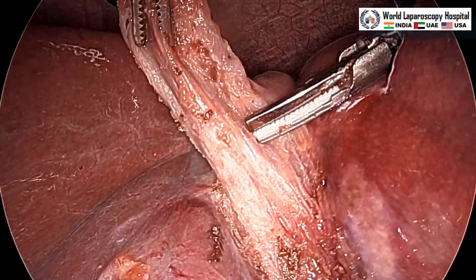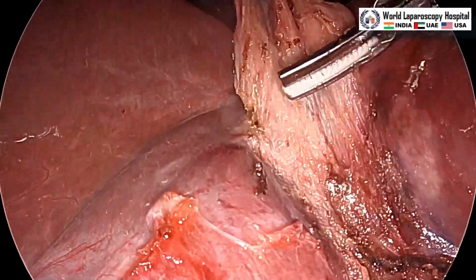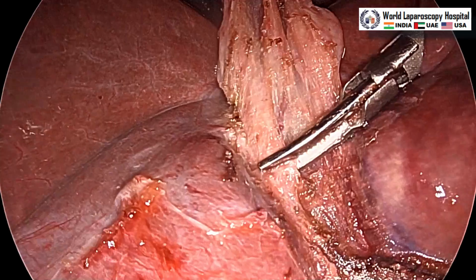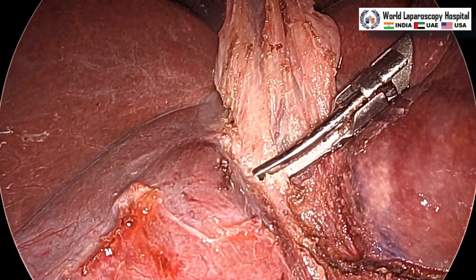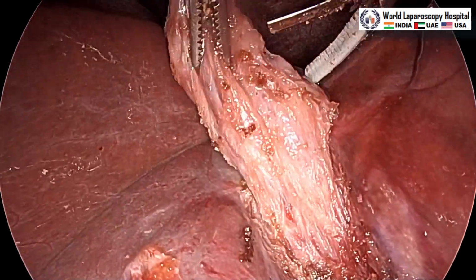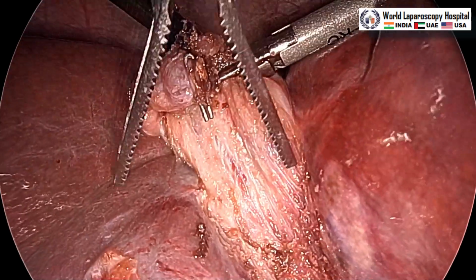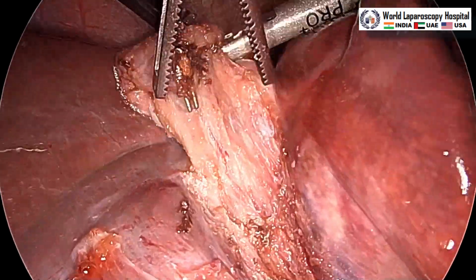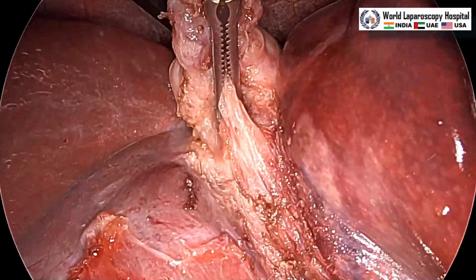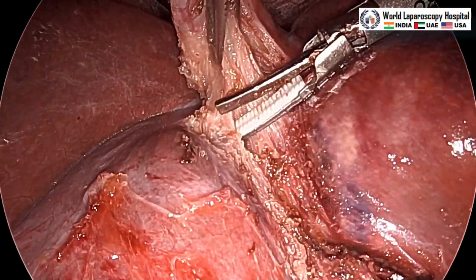Sometimes blunt dissection also is good to make a good areolar plane of dissection. Traction will be optimized to hold with the left hand nearer to the liver, so that proper anteromedial and anterolateral traction can be given to separate the gallbladder from the liver.